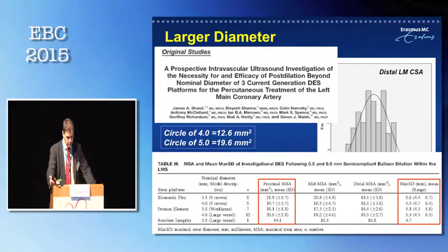If you look at the maximum diameter somewhere in the stent, that's not even mainly at the area of the stenosis, but if you want to have full apposition, to the right you can see on the column you might have 5.6, 5.5 mean or average for the series of stents, and sometimes up to 6.7 or 6.4 millimeters in diameter in certain areas.